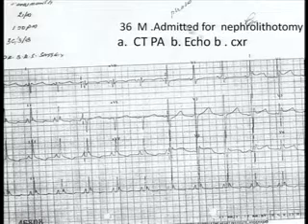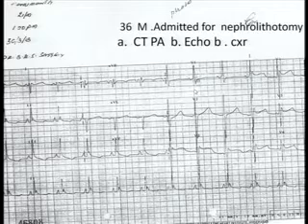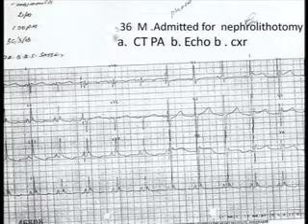A patient who walks in for a routine procedure. You're very right, this is compatible with pulmonary embolism. There's a right axis deviation, monophasic R. Usually when you have pulmonary embolism, you have an incomplete right bundle branch block. This kind of monophasic R, this patient actually had a severe valvular disease, mitral stenosis with severe pulmonary hypertension. So an echocardiogram will solve the problem of making a diagnosis.